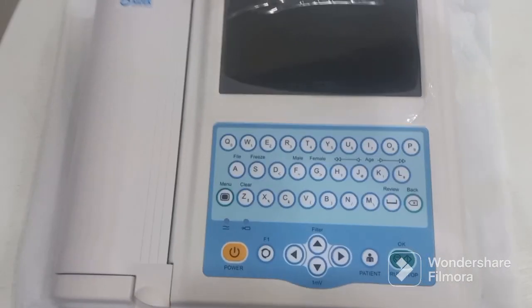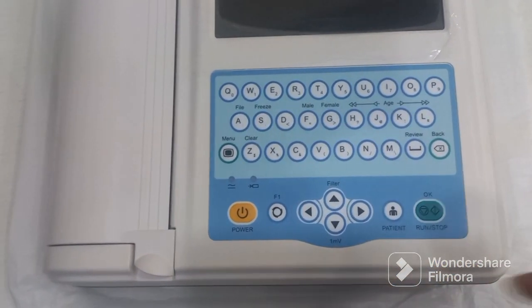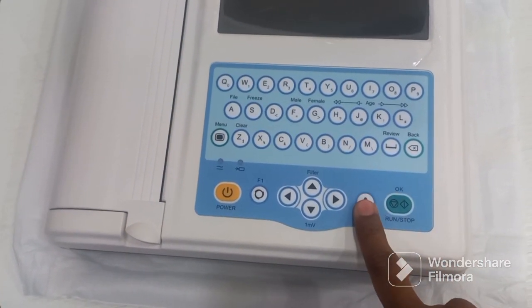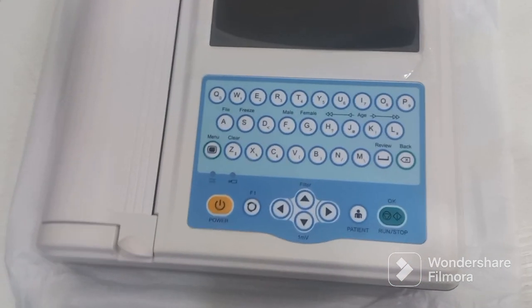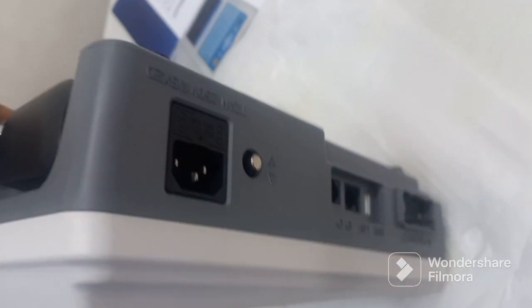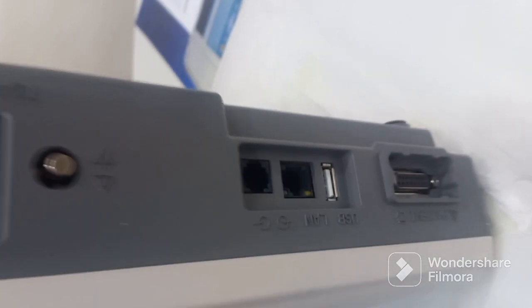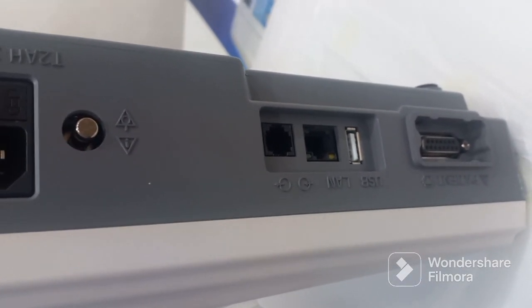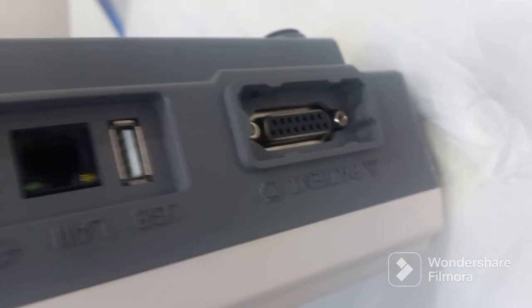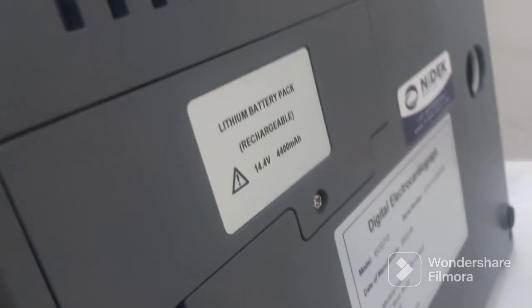You can see the alphanumeric keypad and the navigation buttons. This is the power button, this is the ECG printing button, this is the patient button to feed all the patient details, and this is the menu button. This is the paper compartment, and there is a handle on top of the machine. On the right side you can see there is a power outlet and earthing connection, along with Ethernet LAN, USB, and the ECG patient cable connector.